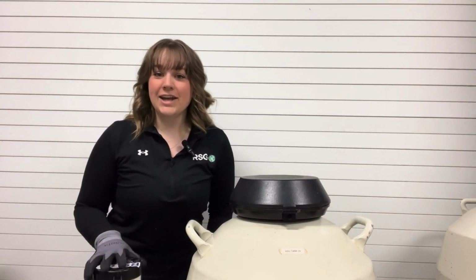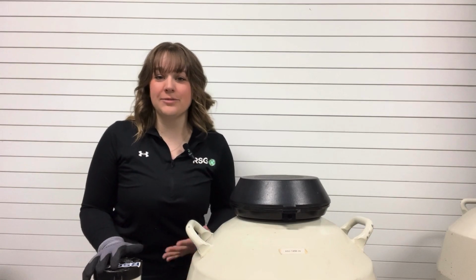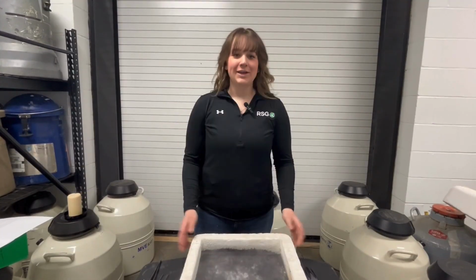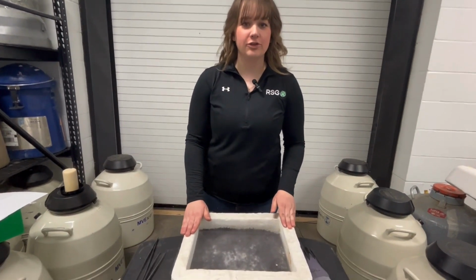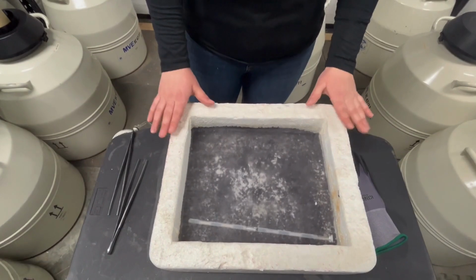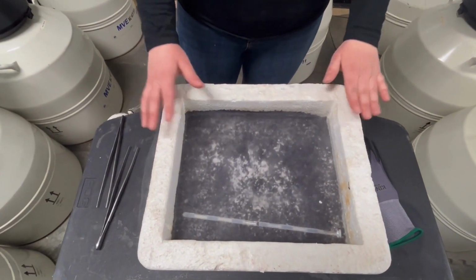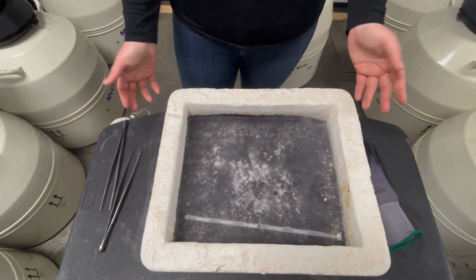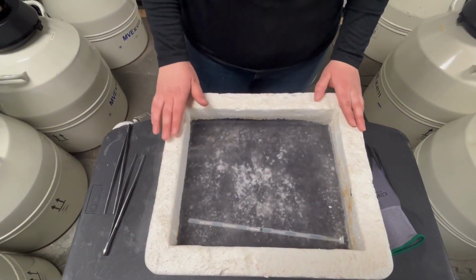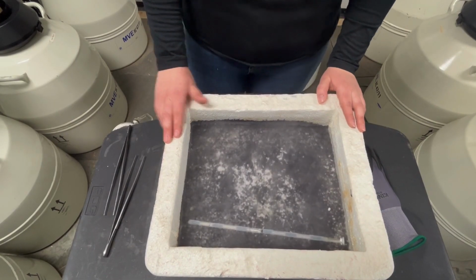Now that we've pulled our semen, let's take a look at how we recommend splitting it if you just need to move a couple straws. So this is the bottom of a styrofoam container, and we've darkened the bottom with some Sharpie so that it's easier to see the straws down in the cane. We've also filled this up with liquid nitrogen. We want to keep our cane submerged at all times while we're splitting our semen. And we also want to remember to reduce the air time that the semen is out of the liquid nitrogen to no more than 3 seconds.